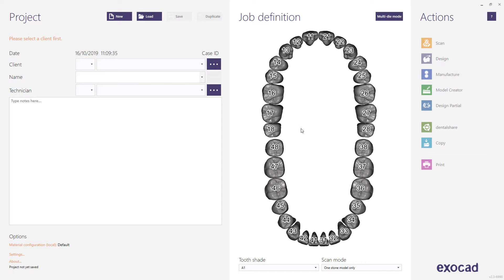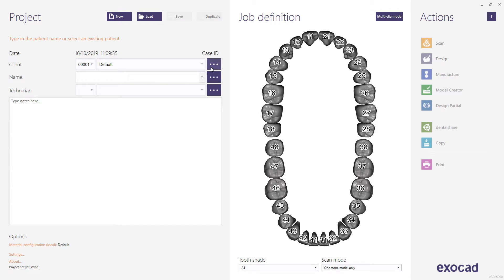Select a client or dentist from the drop-down list. The ellipsis button allows you to add a new client or to select from the existing client list. Enter the name of the patient or case, using the comma to separate the first name and surname. You can use the ellipsis button to enter the patient's details. Select the technician the same way you selected the client. Note, the technician field is not mandatory.